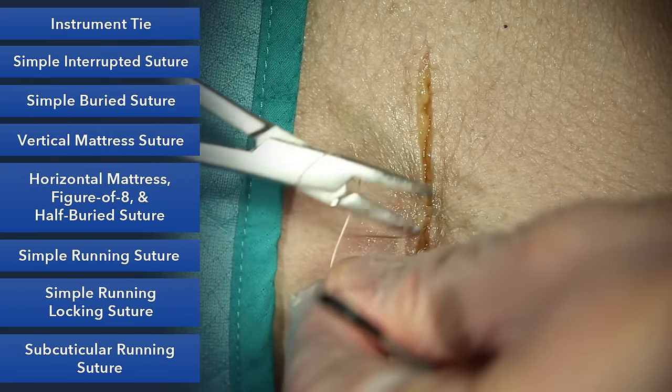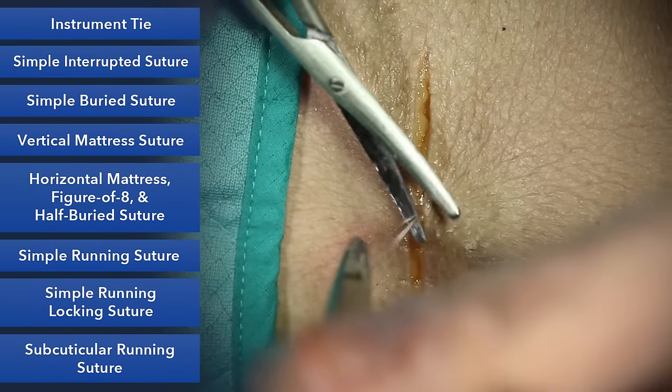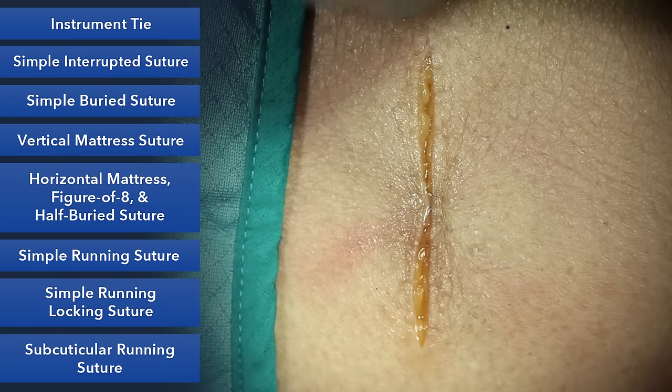And what this does is it takes the tension off the skin so that when you go to do your skin closure, you really can work on approximation. You can see here that helps hold that together. Let's go ahead and do one more.